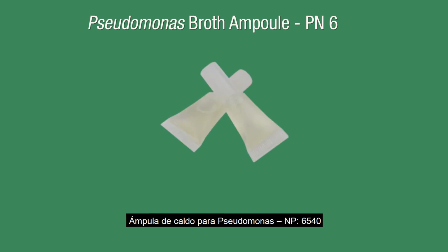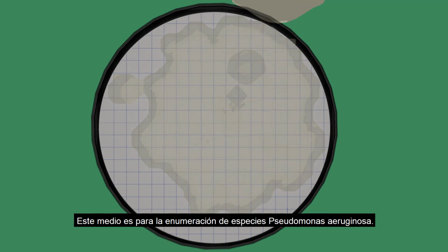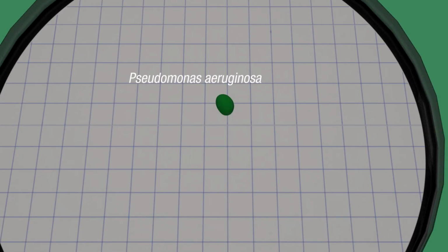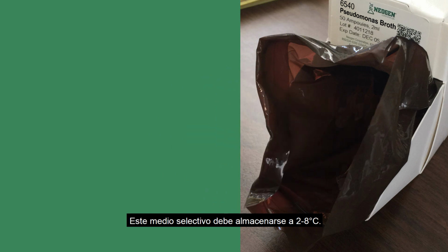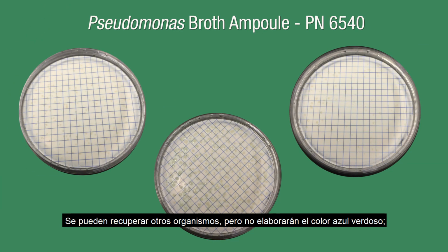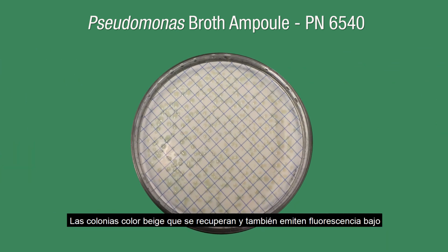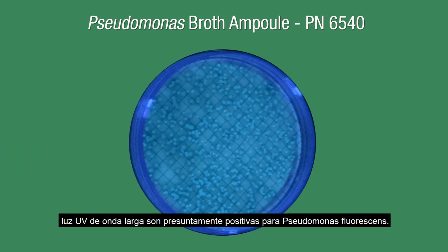Pseudomonas broth ampule. This medium is for the enumeration of Pseudomonas aeruginosa species. This selective medium should be stored at 2 to 8 degrees Celsius. Other organisms may recover, but not elaborate the blue-green color. They will be colorless to beige. Any beige colonies that recover and also fluoresce under long-wave UV light are presumptive positives for Pseudomonas fluorescens.